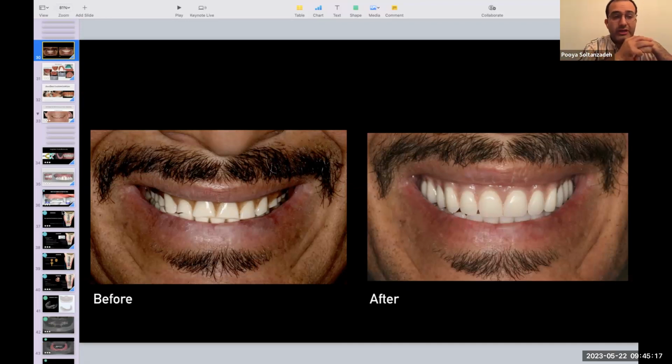And don't forget, you're also providing them some sort of wax rim and base plate. So when you give them the base plate wax rim, you, as a clinician, make the judgment about the occlusal plane being parallel to the interpupillary line and the Fox plane, all those things. As a clinician, you tell them. Then when they give you the digital preview, you again have the opportunity to review that. Another checkpoint would be if you request a 3D printed trial denture, they will give you. I will show you some cases how it comes out. But there are multiple ways to do that.